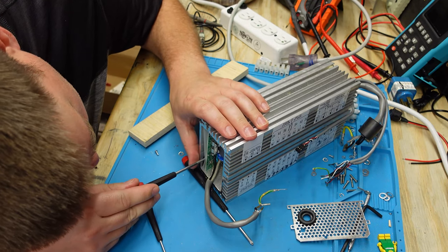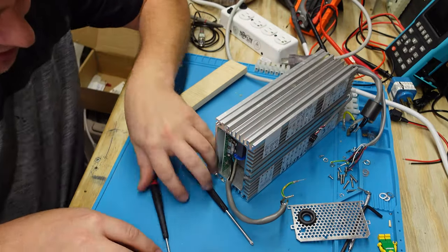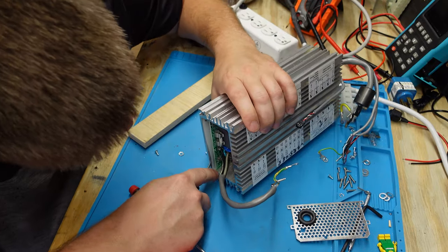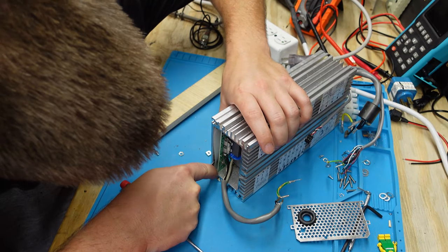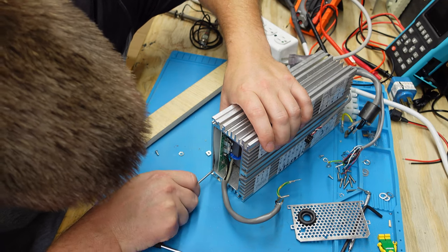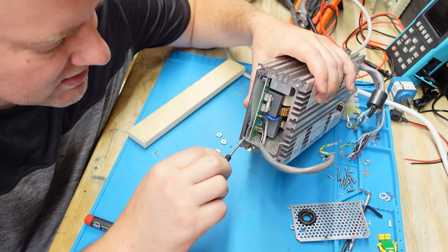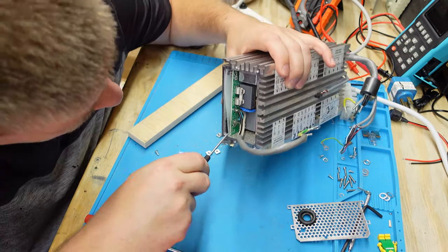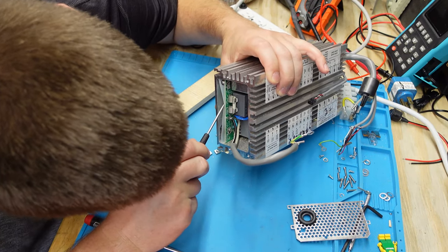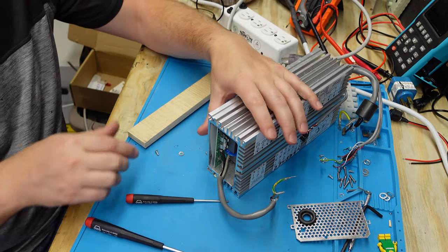Oh my gosh. Yeah, it sure is. So that bridge rectifier that I mentioned earlier, that guy is firmly cemented to the wall. So I've gotta get a flathead screwdriver into the edge and just kind of slowly pry it loose. And there it goes. So I just put it here near the very edge and I rolled it away. And that got it loose. I can't do that to the other ones because they're in the middle of the PCB.